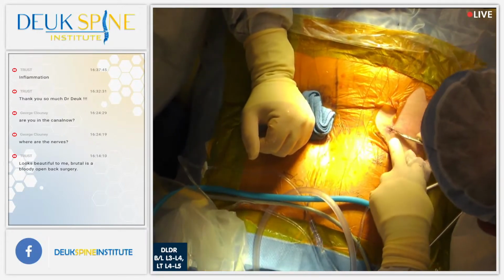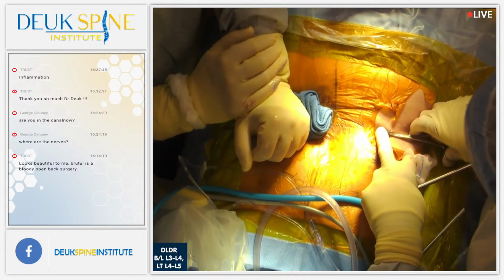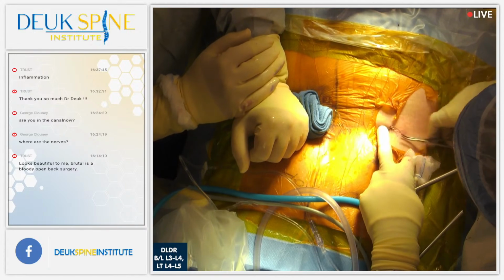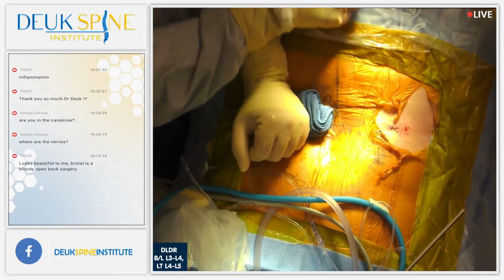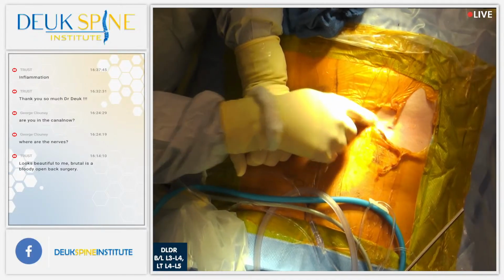Nice job. Here, let me, yep, that's what you got to do right there. That's the move, my friend. Go. Let me have a stapler.